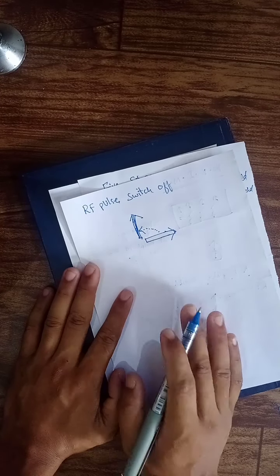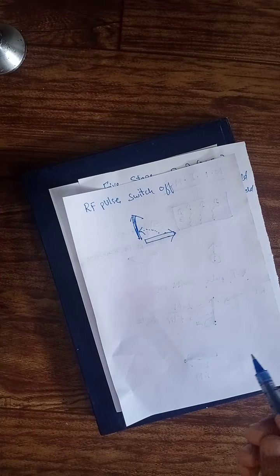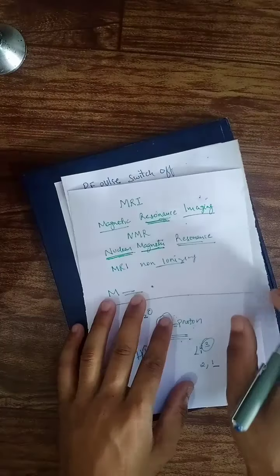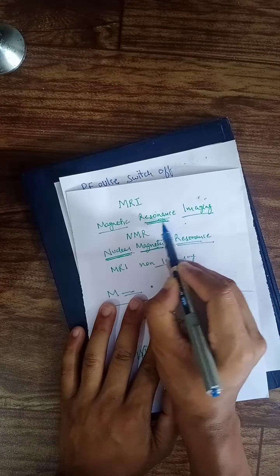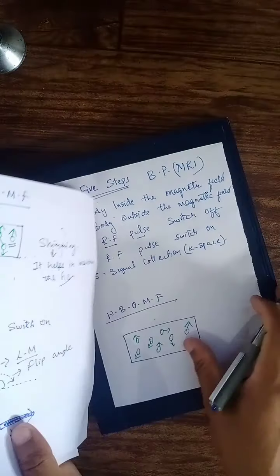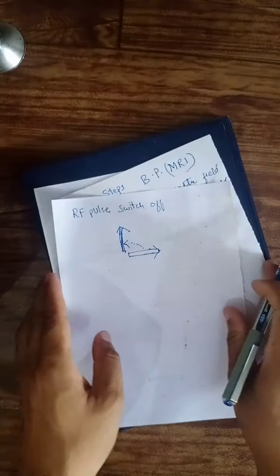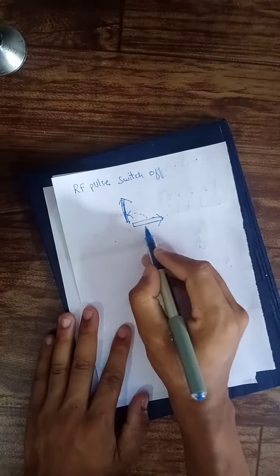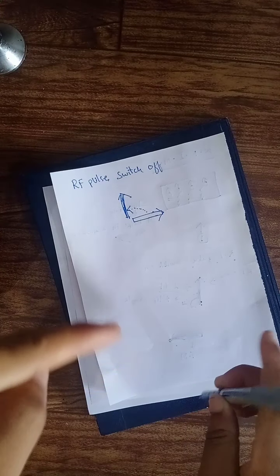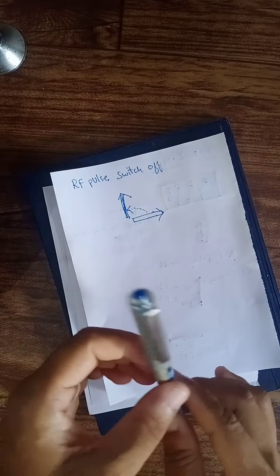So let's discuss the resonance. Remember, we stopped here. I told you I'll be explaining later. So this is resonance. Resonance is like, when the RF pulse comes, because originally you will have your own spin. This proton is spinning and precessing, right?